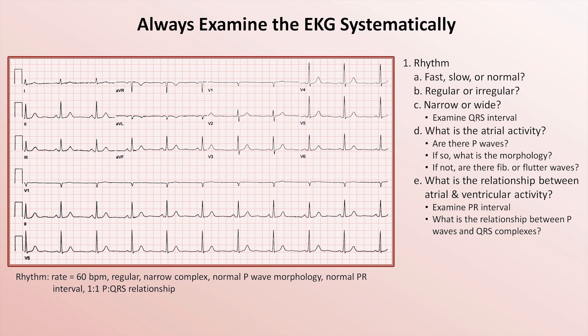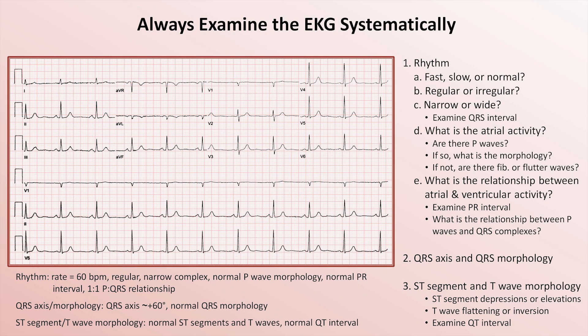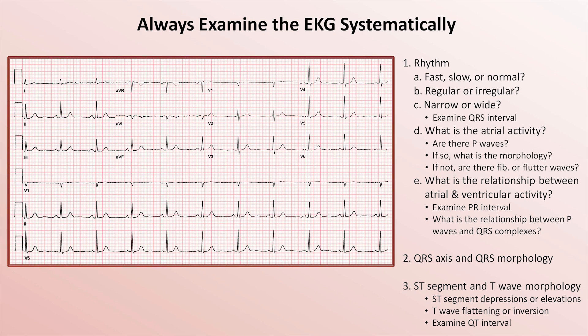The next step in the systematic method is examination of the QRS axis and morphology. The axis is about positive 60 here and the morphology is normal. The final step is examination of the ST segment and T-wave morphology, which also includes assessment of the QT interval. All of those are normal. So if one were to synthesize these findings into a unified impression of the EKG, one would say that it was a normal study.